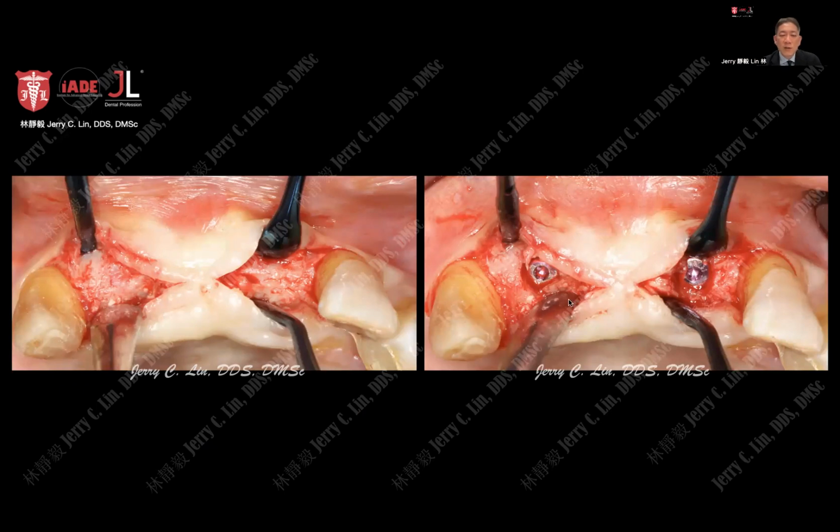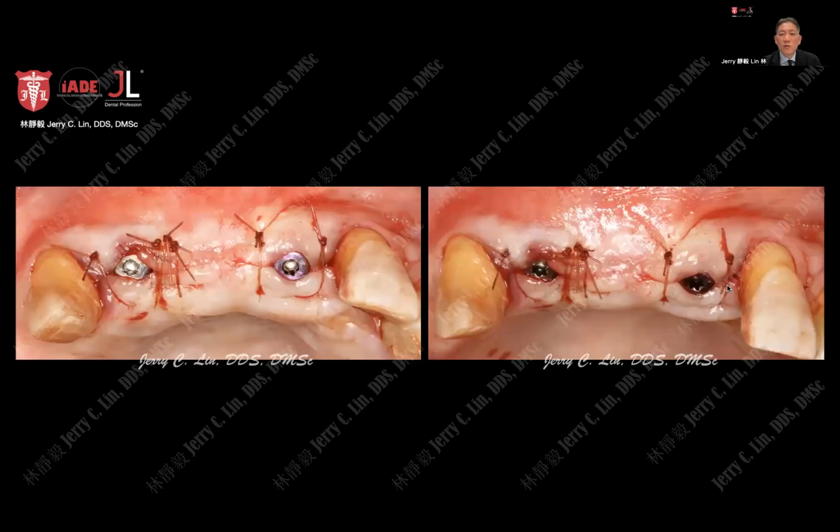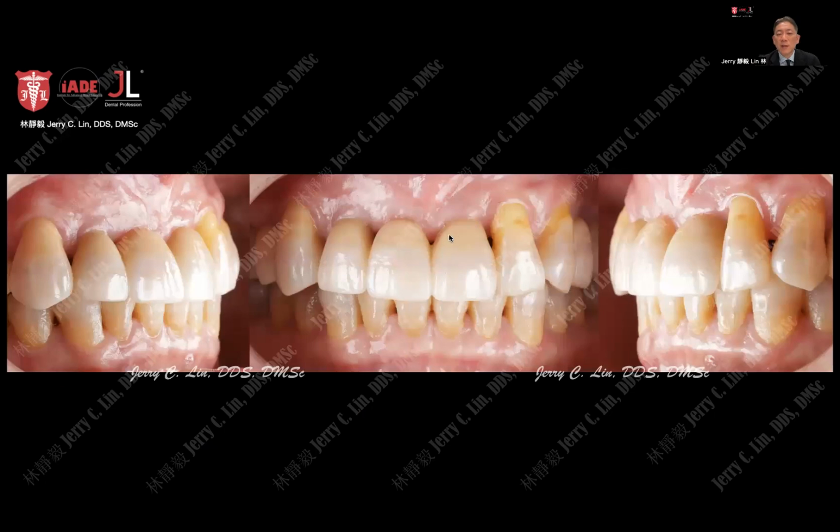And then soft tissue wise, we not only have good bone, we have good soft tissue to begin with in this instance. We have about 3 millimeters of soft tissue in thickness. And for the implant supported bridge, we would like to have a pontic area that mimics the natural teeth look.